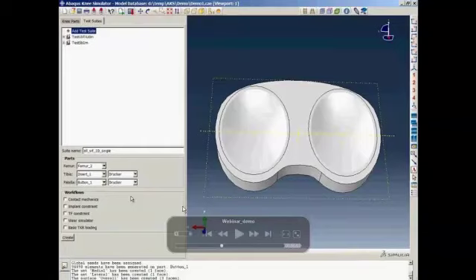So here you can see the material model we just created in the analyst mode has been populated in the drop-down menu and can be selected for the implant parts. So this is one way we envision how the analysts work with the designers. The analysts will create these advanced nonlinear, could be viscoelastic material models for the polymer, while the designer just pick whatever the material the analysts recommend them to use.